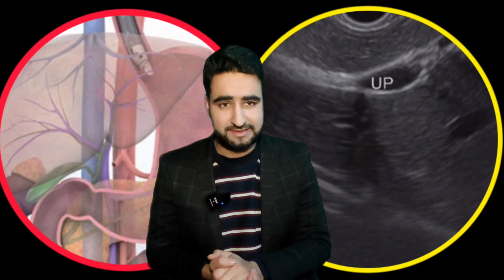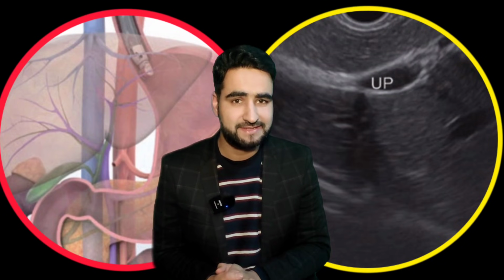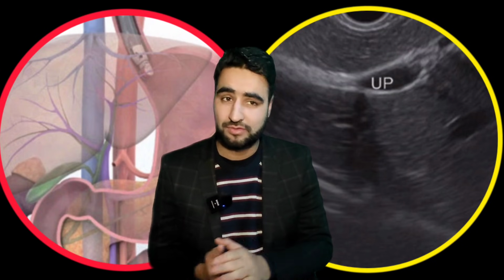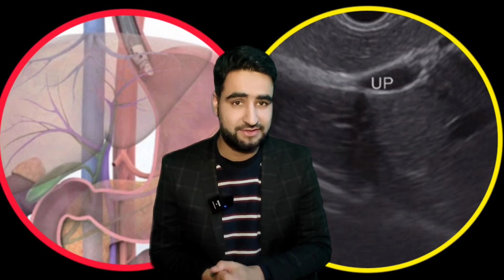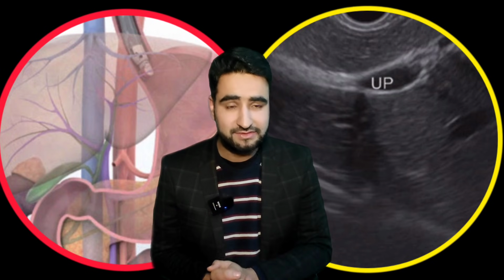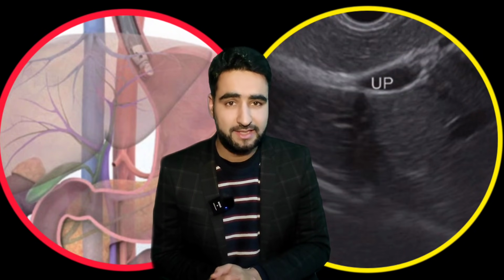On endoscopic ultrasound, it will appear as a hyperechoic curvilinear structure, a bright curved line extending from the left portal vein directing superiorly towards the heart. Remember, superior means right on the endoscopic ultrasound screen. The anatomical significance of this ligament is that it separates segment 2 from segment 4A.